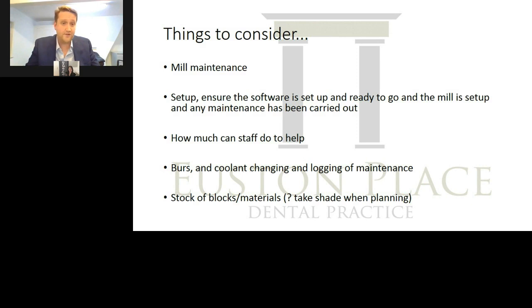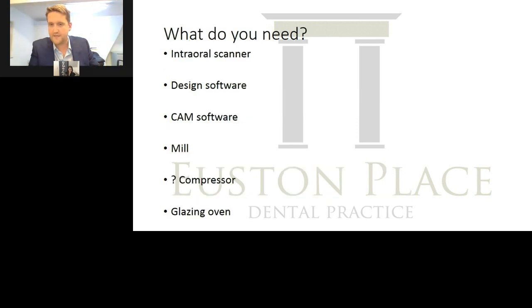It depends whether you're using the Trios on a laptop or the Move, whether you're using the software on there or on a different system. So that's how much can the staff do to help you set all that up. Again, burrs and coolant changing and logging of maintenance. It's relatively straightforward, but it all needs to be done. And then stocks of blocks and material. So taking the shade and planning that when you come to actually plan the crown, rather than on the day take the shade and discover you haven't got that in stock and can't do it. So again, I'll talk about that a bit later with some cases.